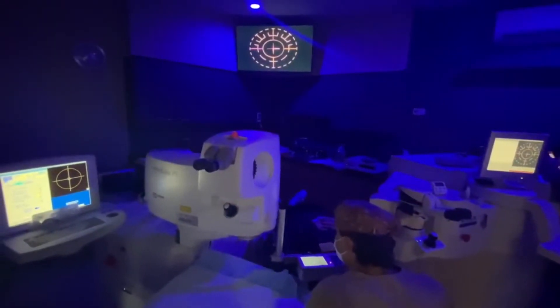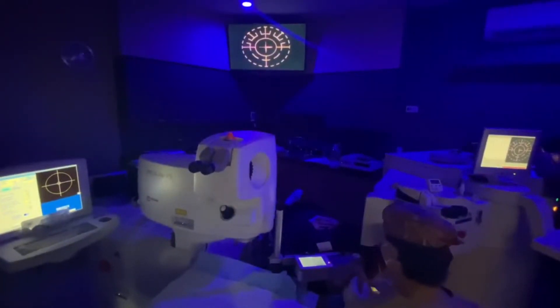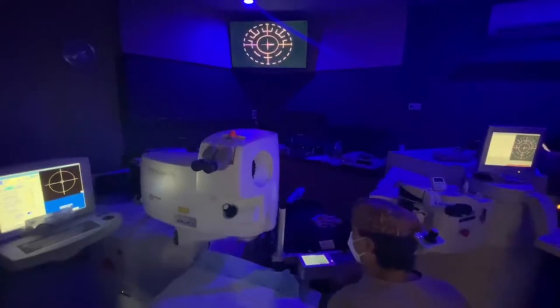Are you comfortable? Yeah. Doing very well. This is collagen cross-linking going on and you can see the pulsing therapy following this little protocol here.